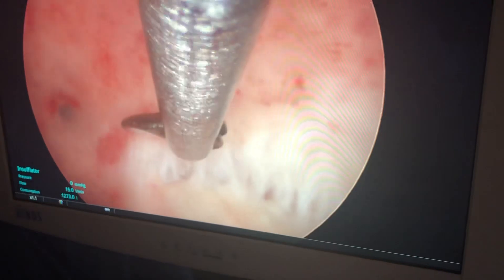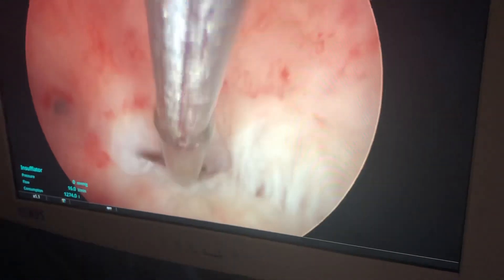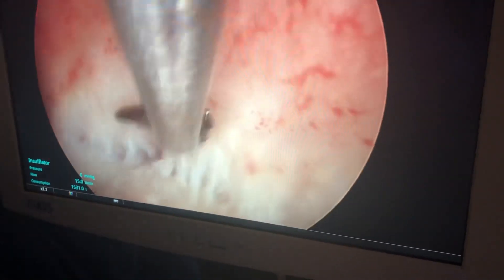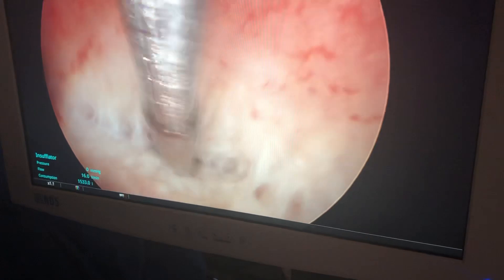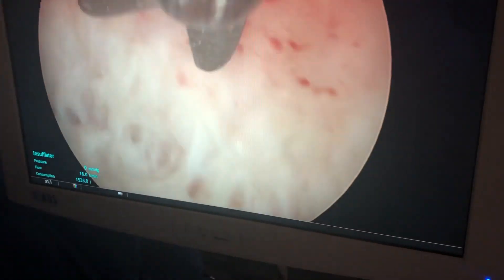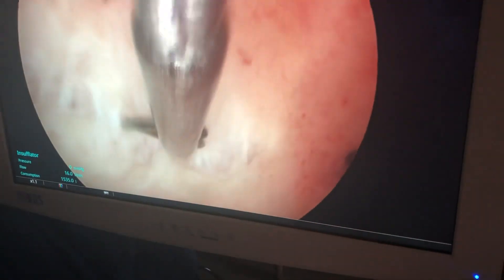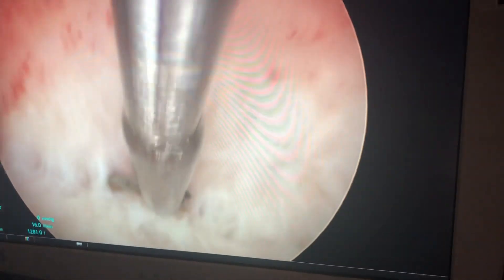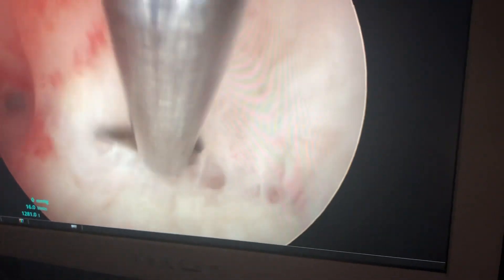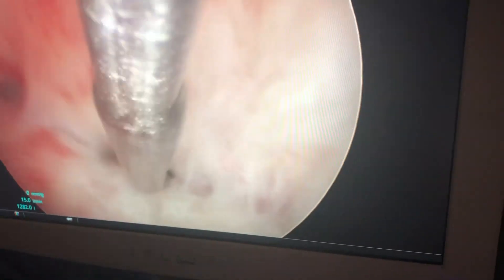You can see this white fibrous tissue — you can see these white fiber bands here, you can see them giving way. A septum does not have good blood supply and it doesn't bleed. You can see there's absolutely no bleeding doing this, confirming that we have a septum. We're continuing across here, cutting very carefully and slowly. I do hundreds and hundreds of these so I can move fairly quickly because I'm very comfortable doing this. You'll see when we start getting up to the other side of the septum, the uterus should become pink, and we'll start to see blood vessels. You can start seeing a little bit of pink sneaking out underneath this — it's called septum resection.